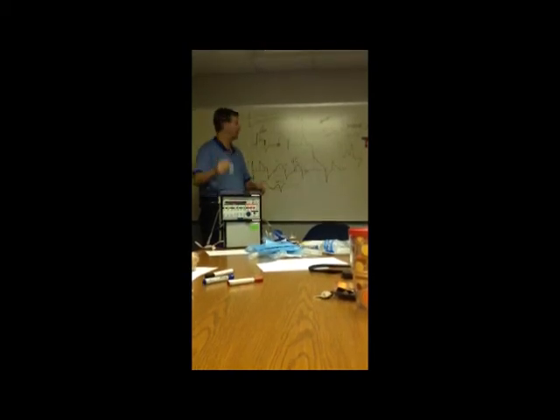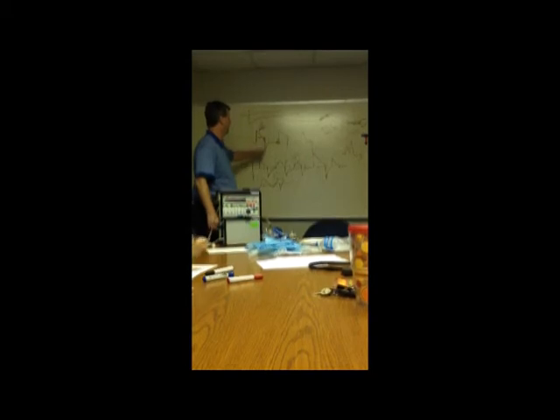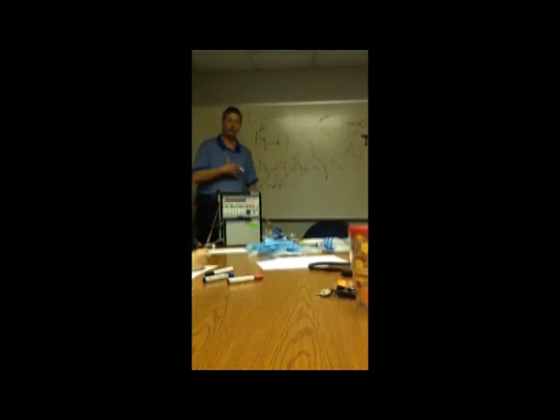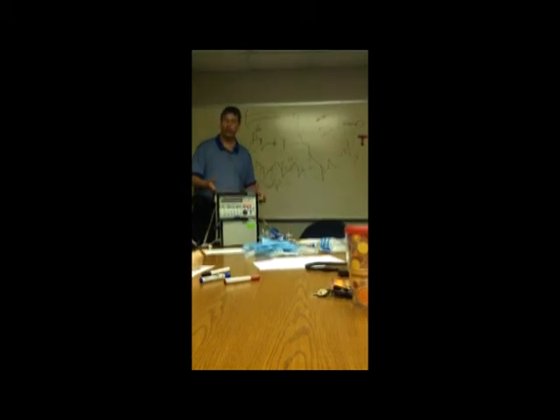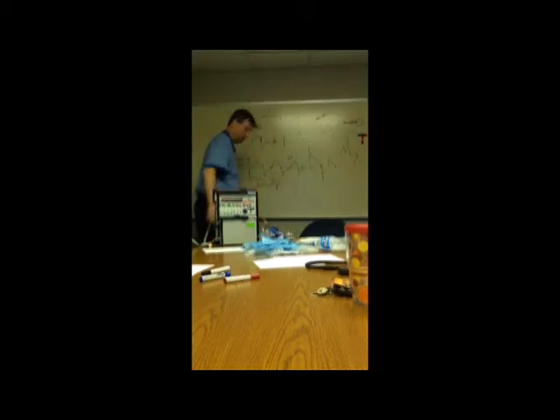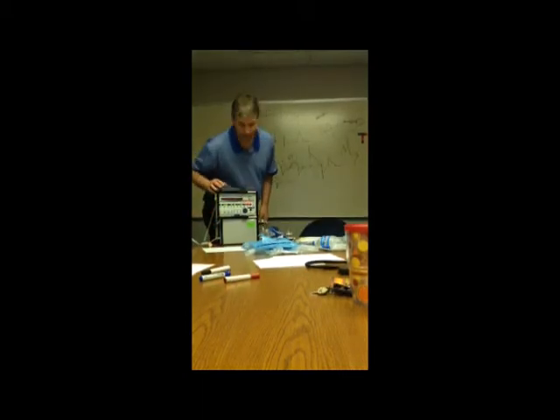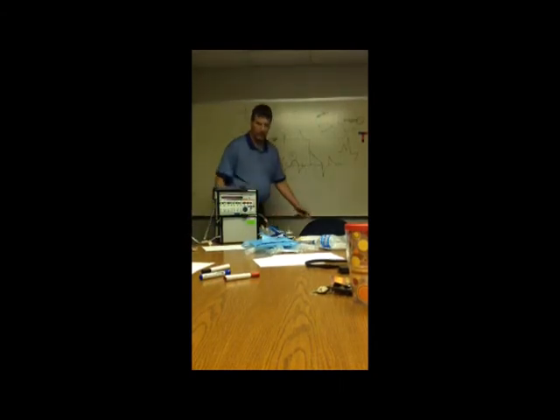Volume ventilation says, I'm going to deliver whatever volume you put. I'm going to blow 500 into their lungs, and I'm going to do it in this amount of time. It calculates, that means I'm going to have to start blowing at 62 liters a minute. That's where it knows to start. It blows till that volume is delivered, and it lets it out. We use pressure ventilation. A lot of hospitals are still using volume, so you're going to get that.